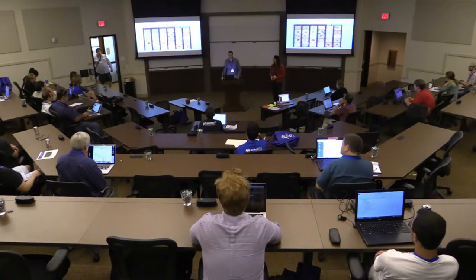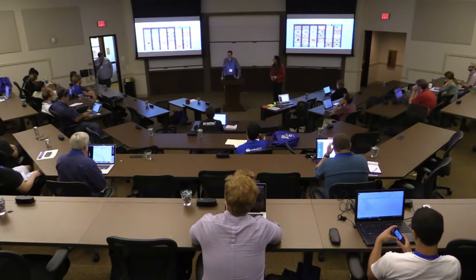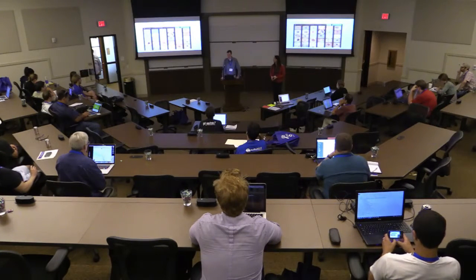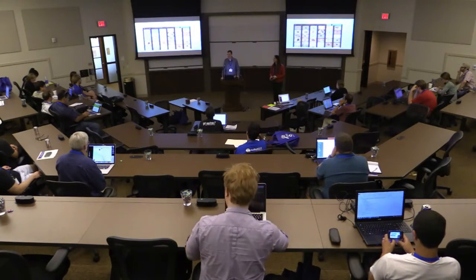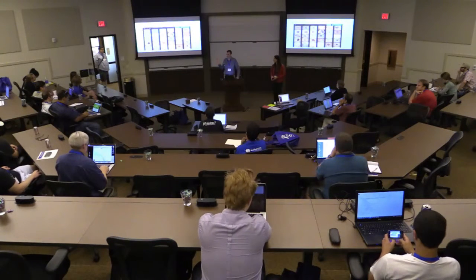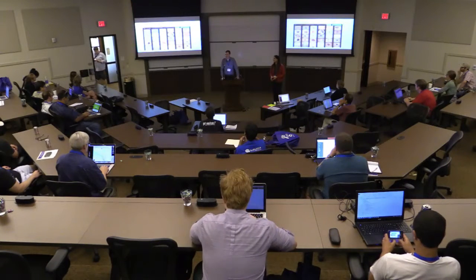Yes, absolutely. So at the moment, we're attempting to not wade into that because we don't want to necessarily be accused of biasing these images. So we present the images as they are, and in fact, we have criteria for things like the size of the monitor, how far the user is to sit away from the screen, and things like that. If we wanted to start getting our own hand into post-processing these images for image quality, we could, but we might have some people who object that the clinical fidelity is being compromised.